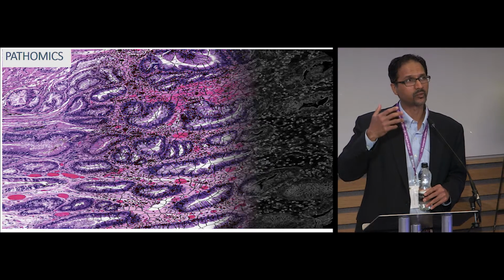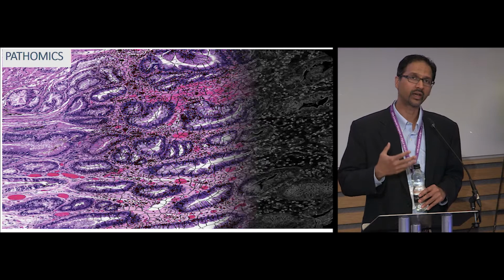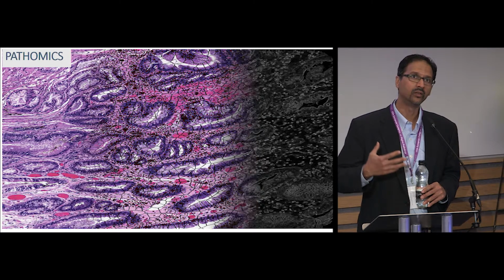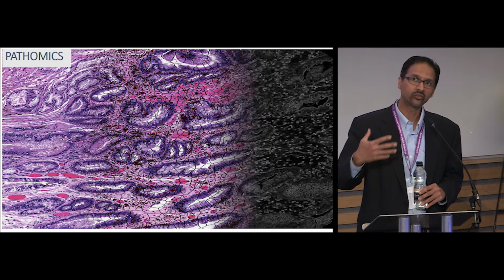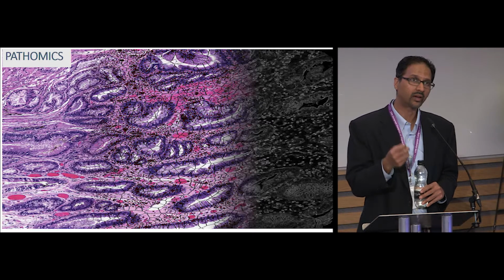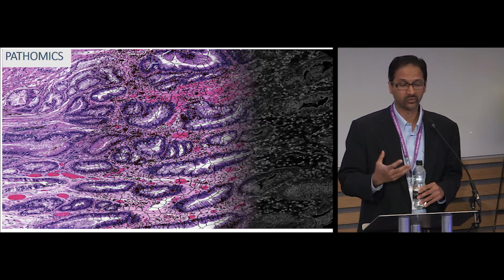Also, by sampling multiple different slides from the tumor, you have a better shot at comprehensively capturing the totality of the intratumoral morphologic heterogeneity in a way that one of these molecular companion tests may not really be able to effectively do.